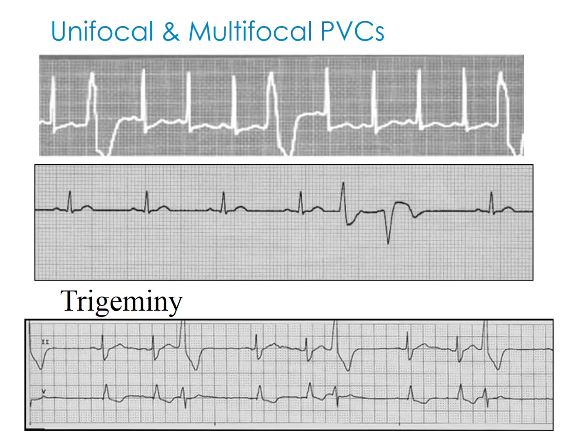If you look down on the second strip, if you're looking at your PQRS complexes, if you count over 1, 2, 3, 4, 5, 6, those fifth and sixth ones look like PVCs to me, and it goes back into your normal QRS complex. So that could be a multifocal PVC on that one too, where we've got 2 of them and they're back to back. With that type of PVC, your client may tell you, I feel my heart skipping a beat or something, because it may not be contracting as effectively as it could.